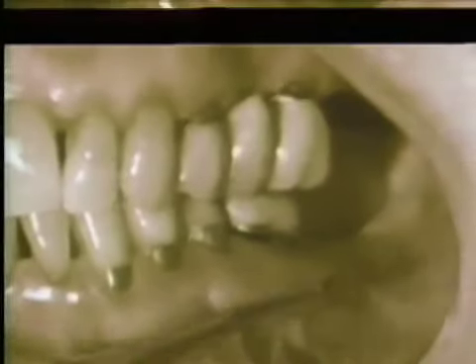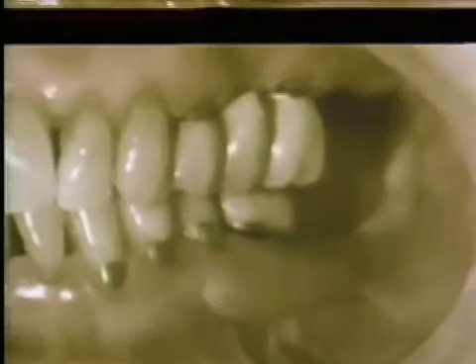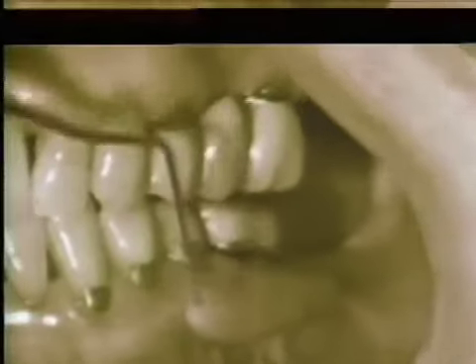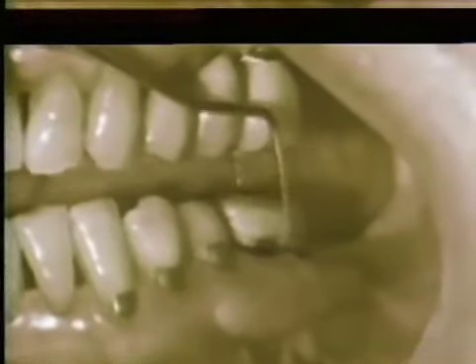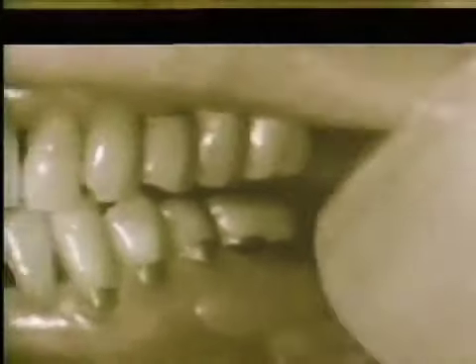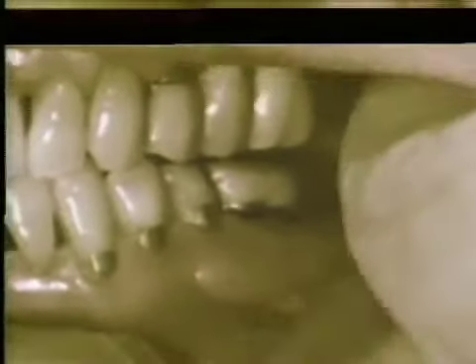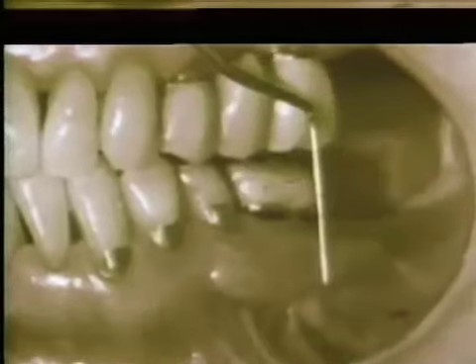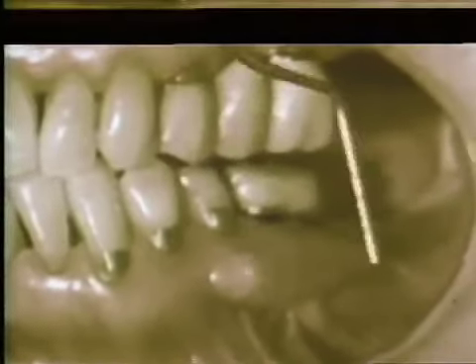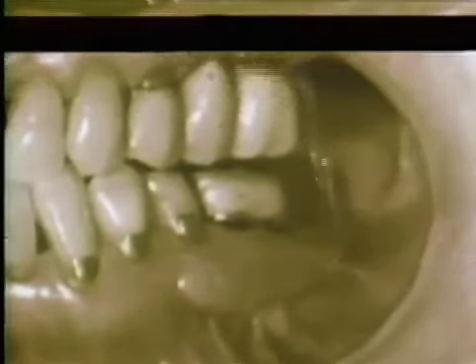A post-operative view taken 5 weeks later shows that the gingival graft has survived. It replaces the alveolar mucosa that was on the buccal surface of the molar tooth. The probe reaches to the superior border of the graft when it is introduced into the buccal gingival sulcus. Muscle trimming demonstrates that the gingival graft acts as a buffer to prevent the muscles of facial expression from putting tension on the gingival margin. Approximately 6 millimeters of gingiva has been added in this site. The donor site in the maxilla has completely healed.